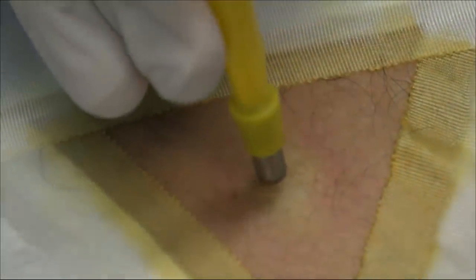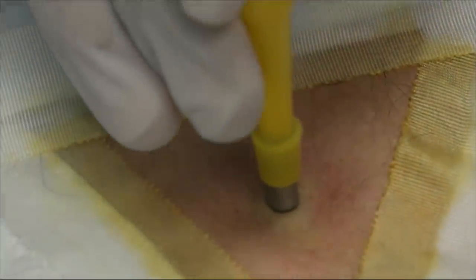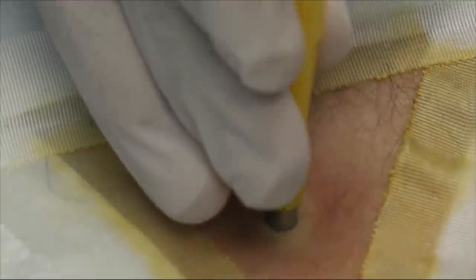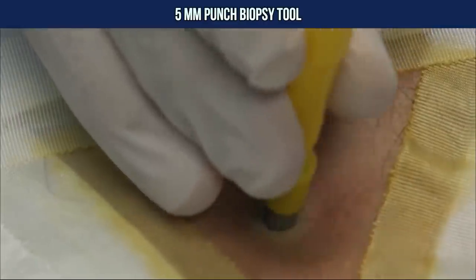So let's pull a timeout. All right, we're rolling again. So I'm gonna show my friend Boom Boom here — I think I showed you that, didn't I? That is what the punch biopsy tool looks like. This is a five millimeter punch biopsy tool. So we're just gonna take it and go right over the top of this little cyst, just like we would if we were doing a punch biopsy of a suspicious skin lesion.